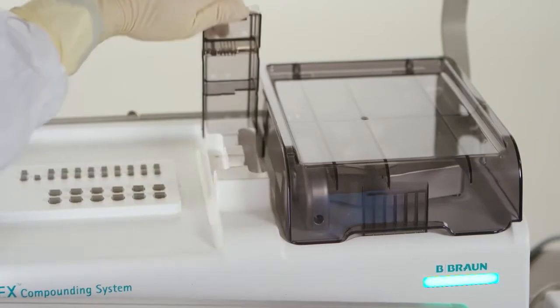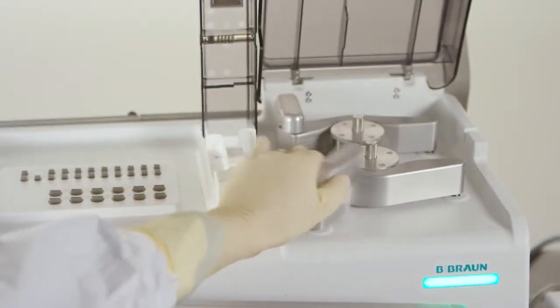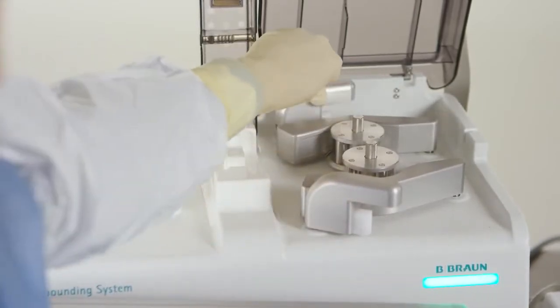To install the transfer set on the compounder, lift the detection sensor and pump doors and rotate the platen locks away from the platen to unlock.